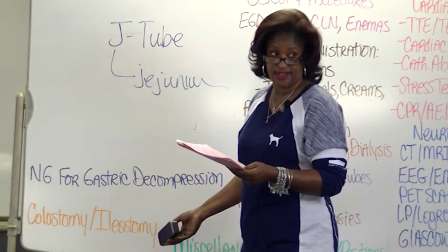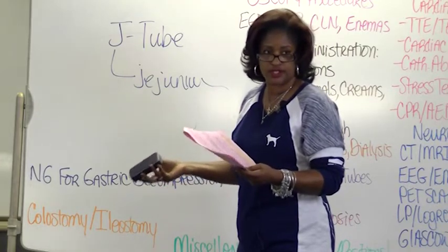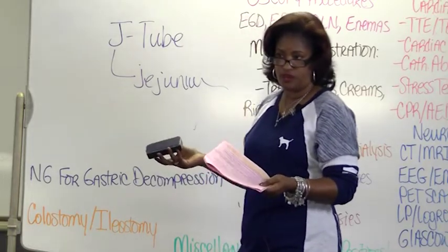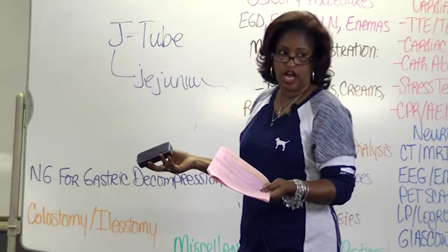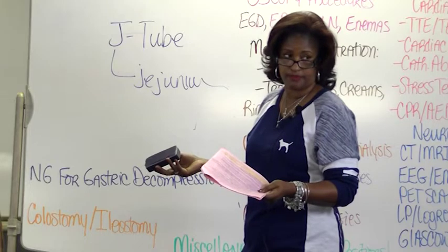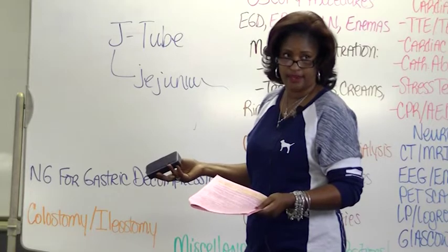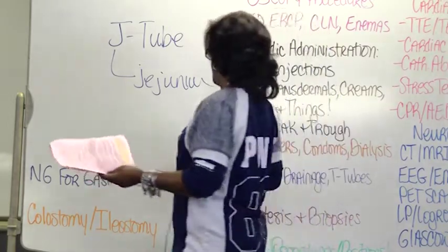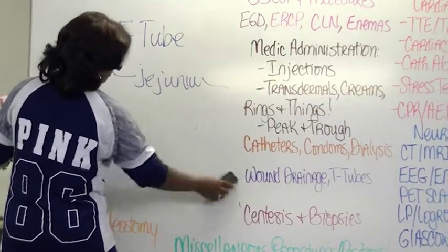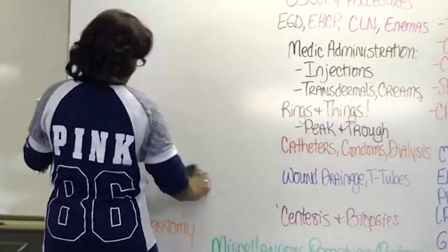Less than 5. It's like 2 to 5, right? So it's less than 5. Do you see how you can't screw this up if you just quickly check a litmus paper? The pH is so different. Now, before I let this go, because I probably should not, what color would it change if it was in the small intestine? What color would it change the litmus paper? Good, good job, blue. Alkaline is blue. Remember that, everyone. Alkaline is blue. Acid is yellowish, kind of orange, yellow, orangey yellow. If it's real acid, it's almost red.